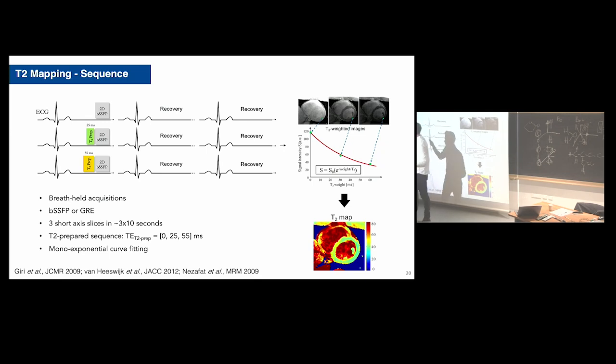And that's what Philips, Siemens, and GE do in their systems. This is interesting because this T2 prep was developed by Matthias here. The story is very interesting, so please ask Matthias about the T2 prep and the patents, etc. It's really interesting. This works in 9 heartbeats, and we have 2 recovery heartbeats between the acquisitions.